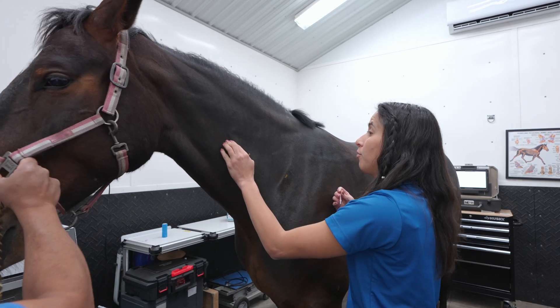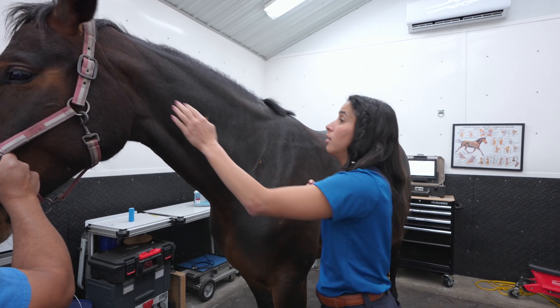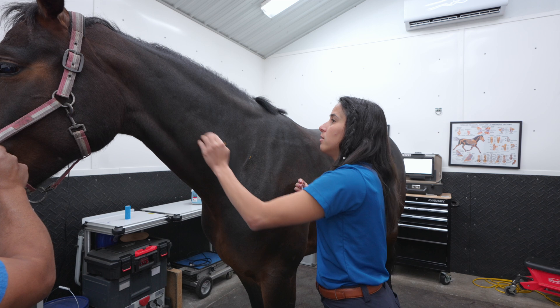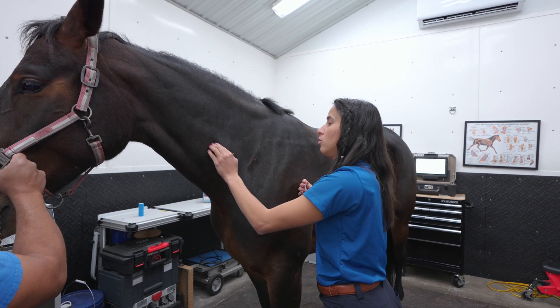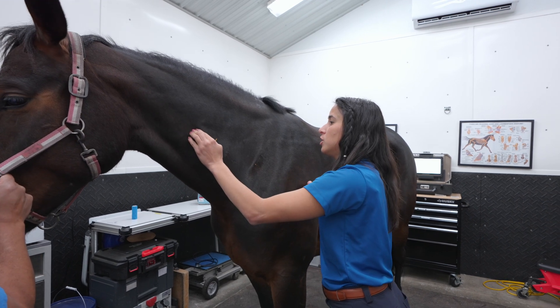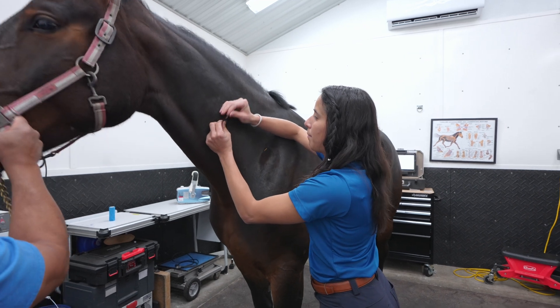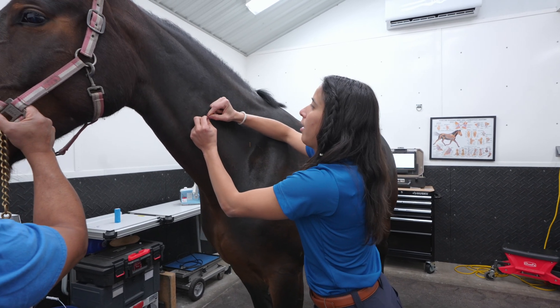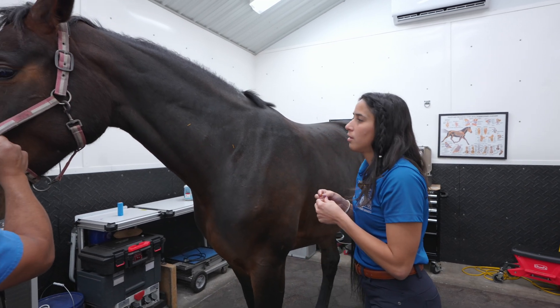On the neck region, horses have a lot of tension because they use their neck a lot for walking. I try to find certain points where I feel knots in between each cervical region, and then I go on that point — that will help reduce the tension on that knot in that region.